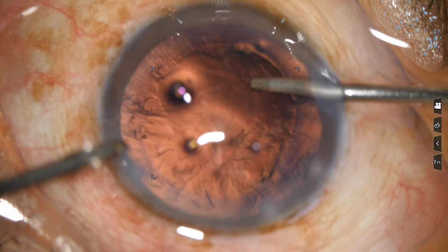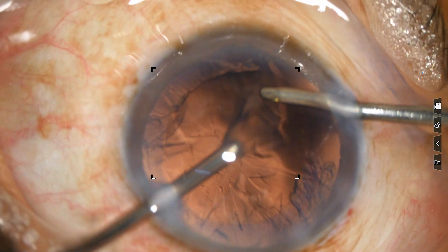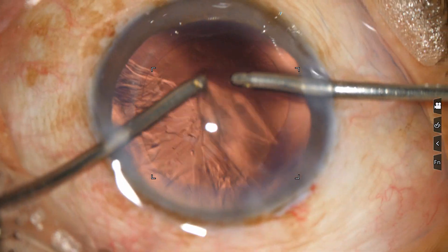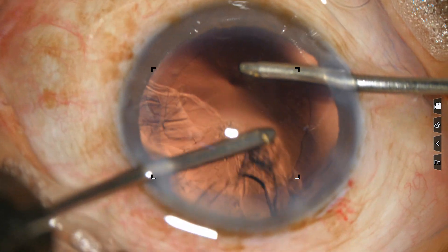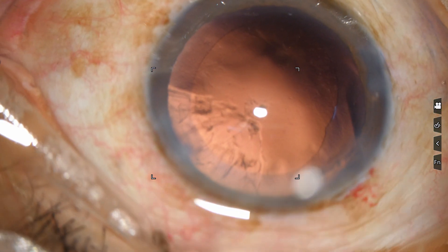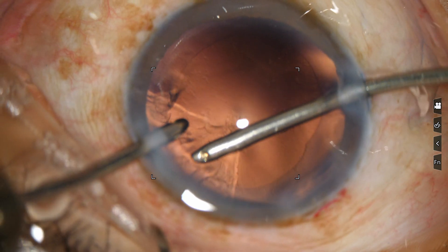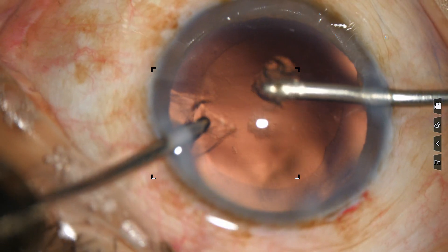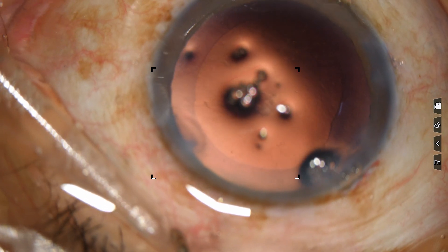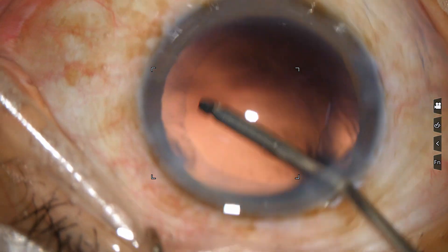Very good — it's finished. Now for this part you have to change sides. The cortex here — irrigation from this side as well, over there. Now can you see some plugs? Irrigate over there. Now it will be clear.